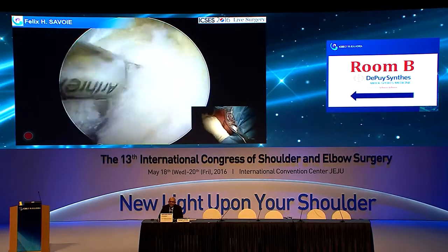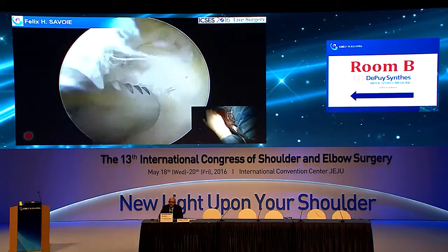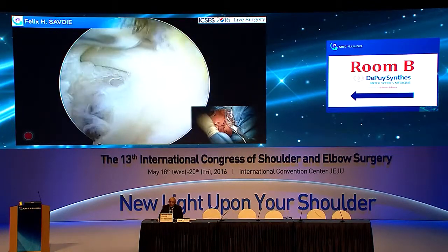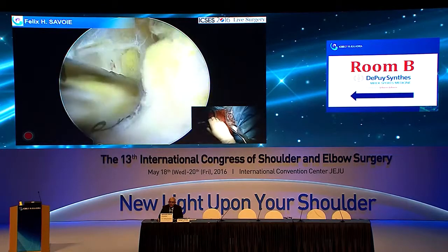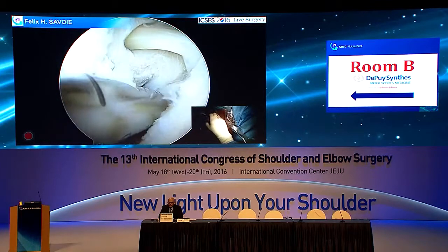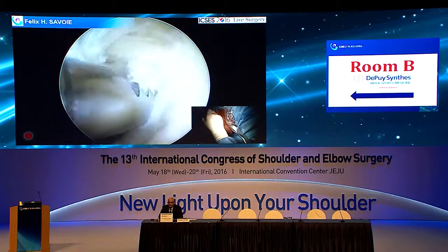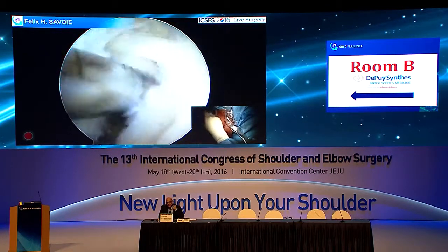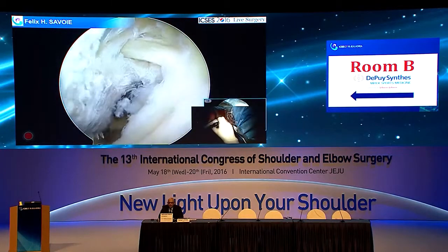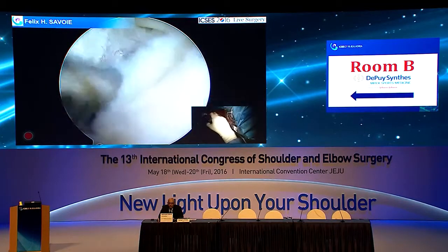That's actually pretty rare. I think it's about 1 in 50, 1 in 100 cases, the last time we looked at our numbers. So we see it a few times a year, but that's an accessory pec minor tendon. You don't have to do anything with it unless they're dyskinetic. And if they're dyskinetic, you can release it. Can you see that? Yeah, we can see it beautifully. Okay, accessory pec minor. That is so cool. All right, so it's a rare thing. I actually wrote that up in a book of Brian Cole's on rare lesions of the shoulder, that if they're having coracoid pain, you can release that and eliminate that coracoid pain. And if they're dyskinetic, you can also release it and they'll do better.